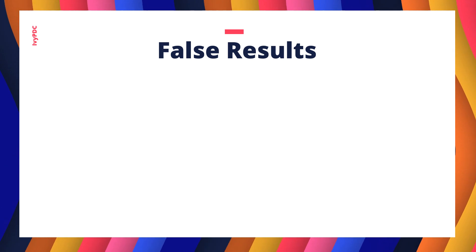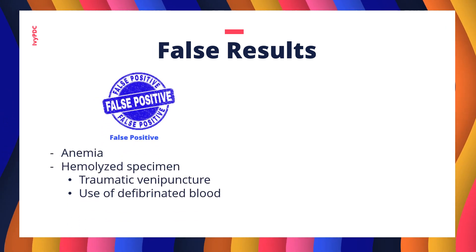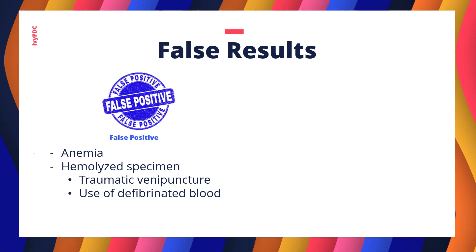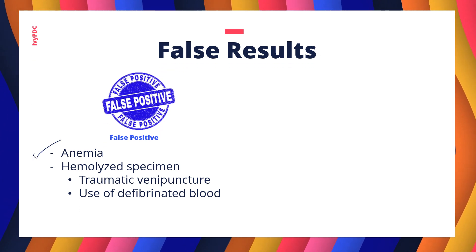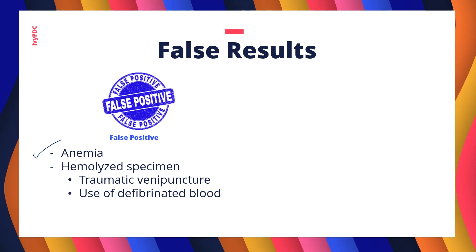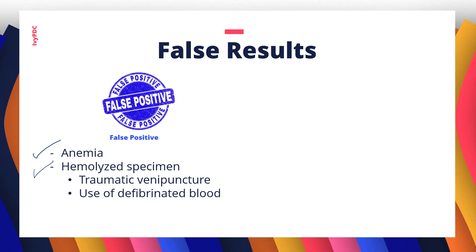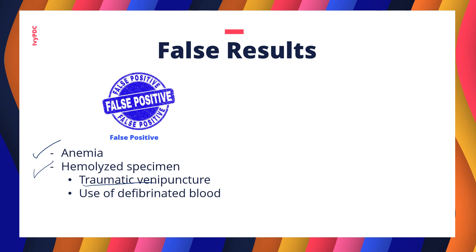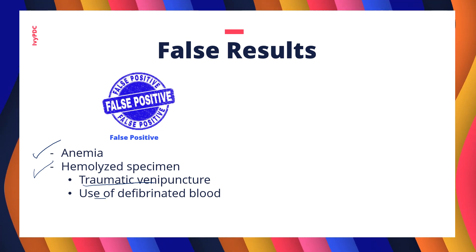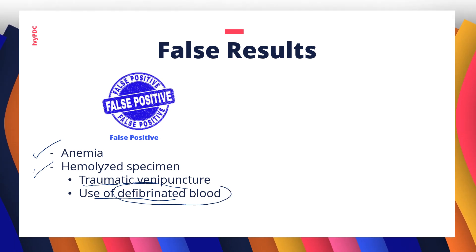Causes of false positive results include severe anemia, where hemolysis may occur even without PNH. Another cause is a hemolyzed specimen, which can result from a traumatic tap, incorrect venipuncture methods, or the use of defibrinated blood, since hemolysis occurs during the defibrination process.